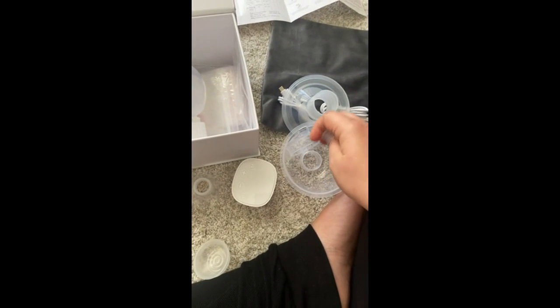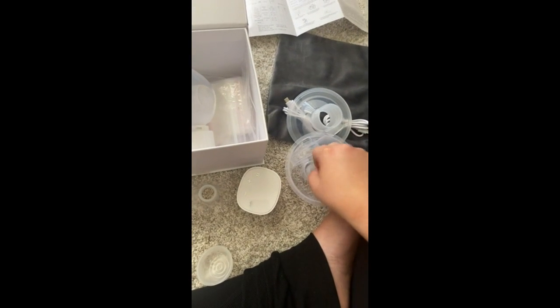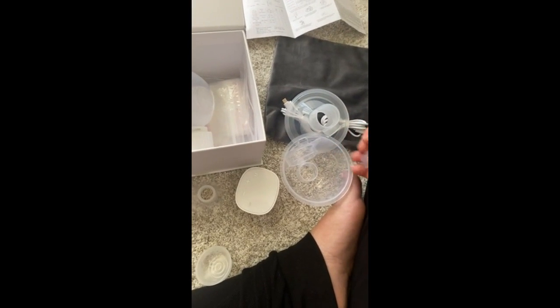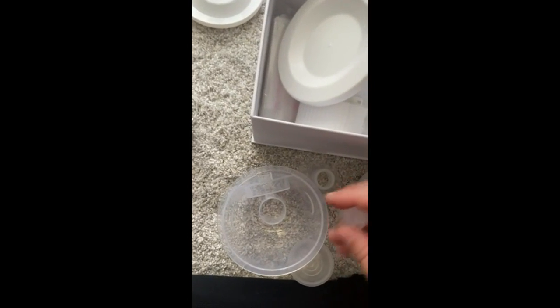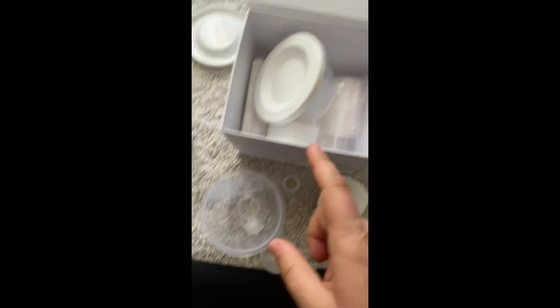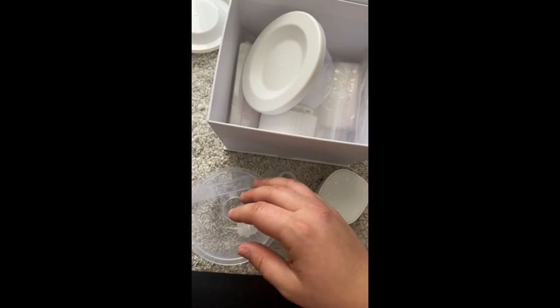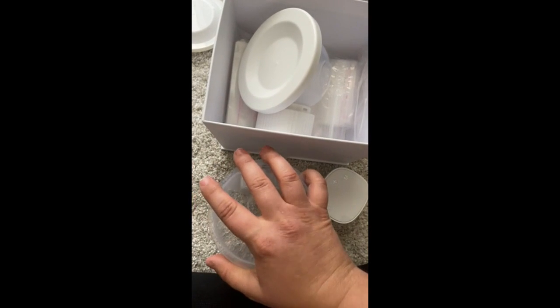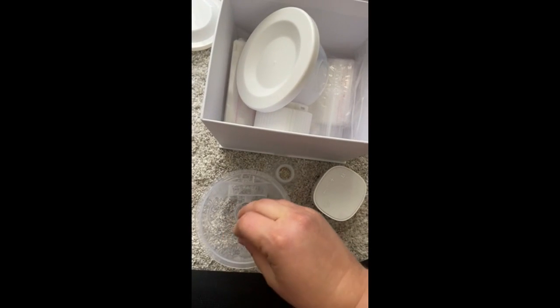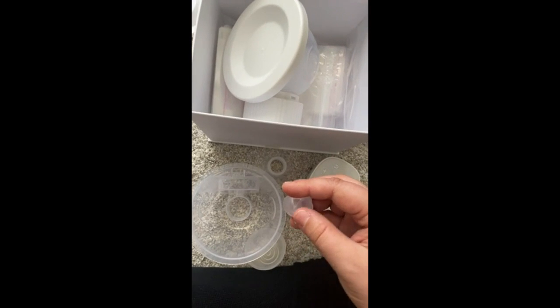I actually had to lower the suction. I mean, every pump is different. I need higher suction on other pumps. And then for this one, I needed just a 4 or 5, and it was adequate. I do know that with other pumps, it goes from the stimulation to the expression on its own once it senses your milk letdown. This one does not necessarily sense your milk letdown. It just has a timer, and it's a 2-minute timer. So it stimulates your nipple for 2 minutes, and then it switches over to the expression mode.